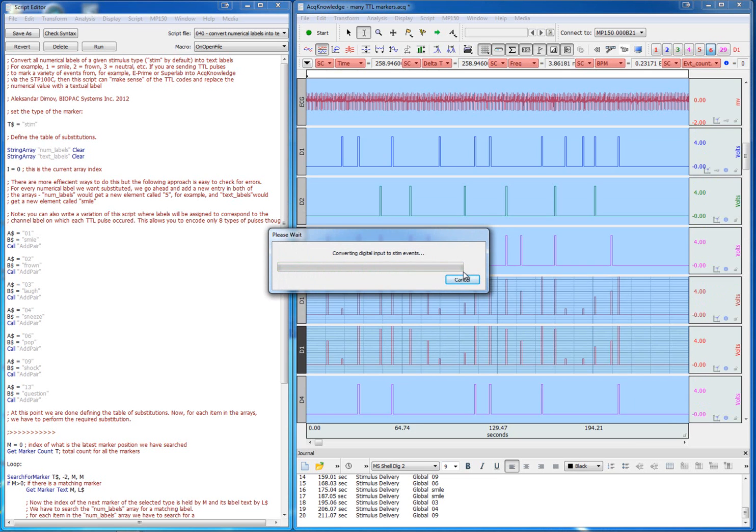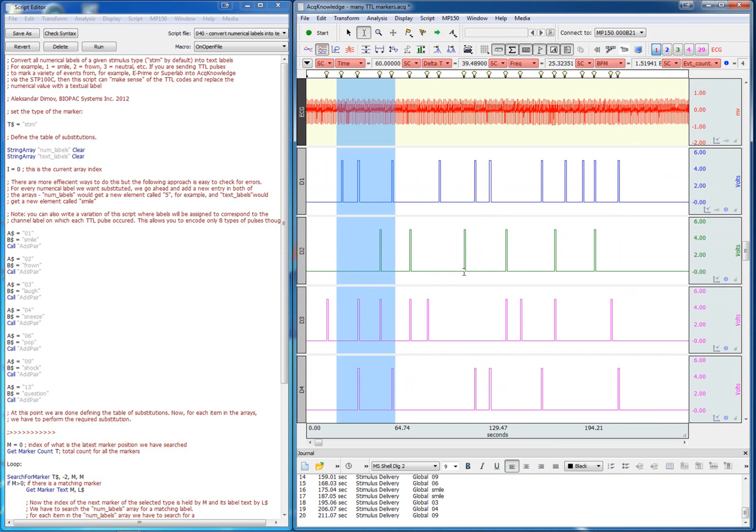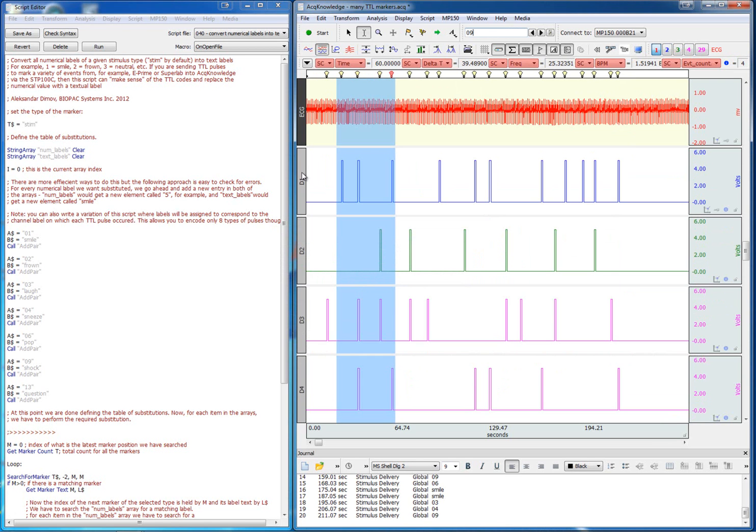The software extracts stimulation markers such as these light bulbs here. These are markers of the stimulation event type and they have numerical labels. These numerical labels correspond to different types of stimulation events.